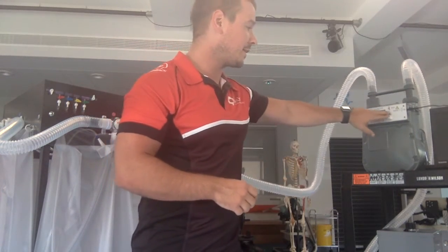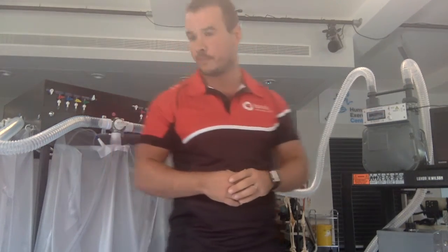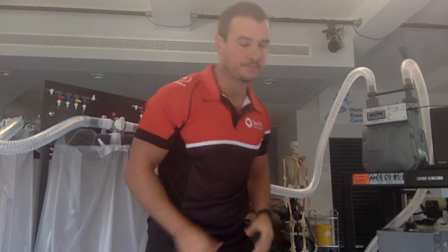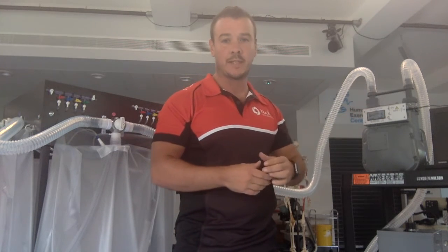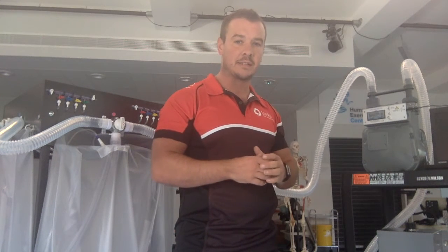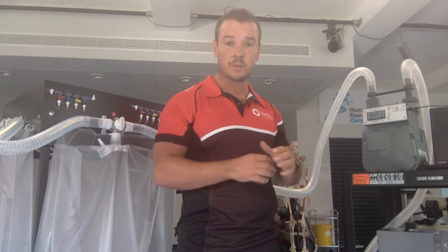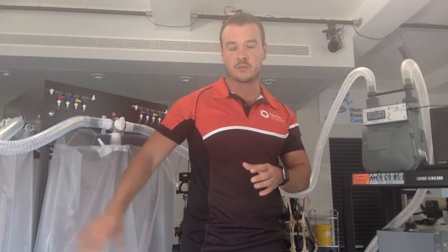Press reset and ensure that the digital display reads 0.0 litres. Open the Douglas bag and switch the vacuum pump on. When you do this, you'll see the digital display increase from one litre, two litres, three litres and so on, and it'll stop just above nine litres. Make sure you make a note of the value at which the digital display stops, because this is the volume of air that's been measured from the Douglas bag.